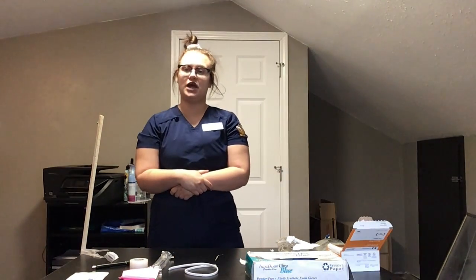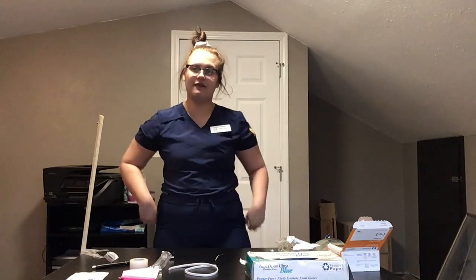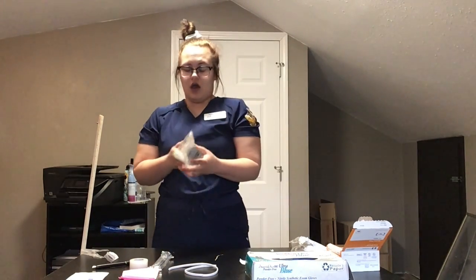Then, after I've checked all that, I would check the physician order in the MAR for the type of IV solution I'm supposed to be using, the infusion rate, the patient, any patient allergies, the type of medication, all of that information. And then after I have checked those things, I would get my IV solution according to the kind of IV solution the doctor told me to use.